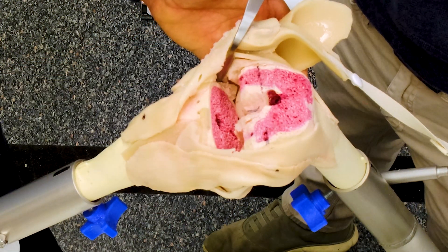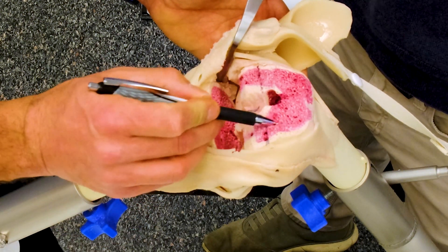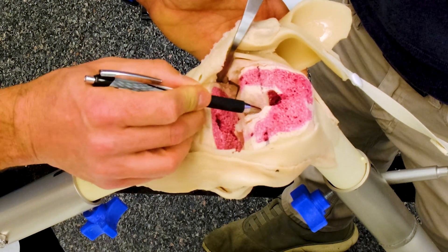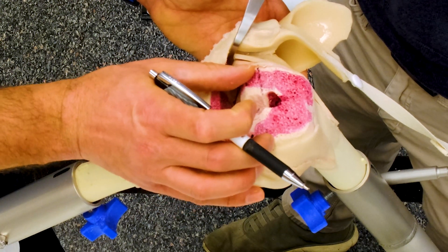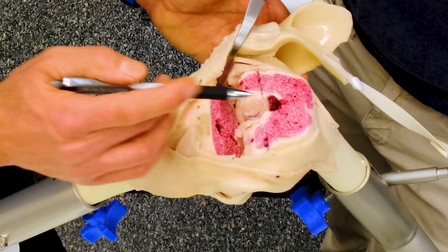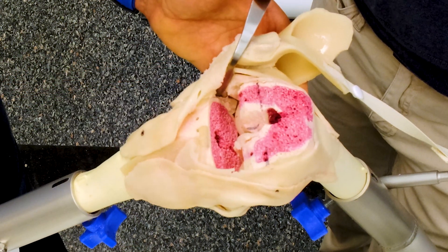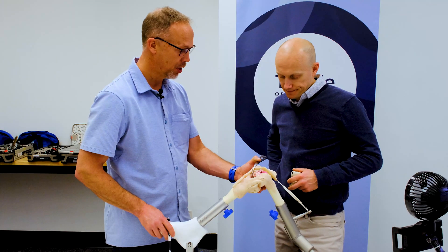What about medialization? If you look right here, you can see where we cut the sulcus, and the sulcus is very medial. If this is midline at the top of the arc, this component is pushed in. Our culprit here is that the component is too medial — we've increased our Q angle by pushing the sulcus too medial, and the patella is trying to drop into it through an arc of motion.